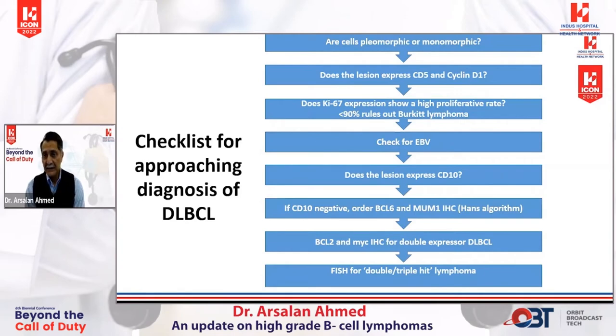Whether pleomorphic or monomorphic, the next thing is, is it CD5 and cyclin D1 positive or negative? If they are positive, they can go into mantle cell lymphoma, blastoid or pleomorphic variant. Is the Ki-67 index less than 90%? If it's more than 90%, it automatically goes into Burkitt's lymphoma. If it's less than 90%, then I start thinking about diffuse large B-cell lymphoma. And we have to check for EBV. If it's EBV positive, everything else is off. It becomes EBV positive diffuse large B-cell lymphoma.